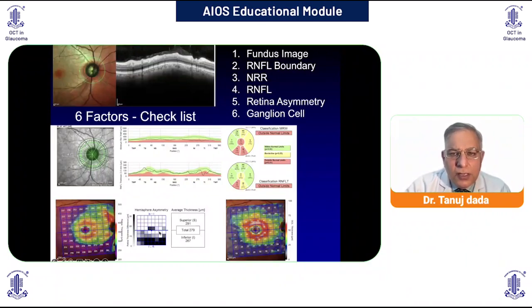And then you see this is the ganglion cell thickness imaging. This is the total retinal thickness. So this thin part of the macula, it is now confirmed that this is occurring due to loss of the retinal ganglion cells. You can see inferiorly, in this area, there is a temporal loss of the retinal ganglion cells, and this is merging with the retinal nerve fiber layer loss.